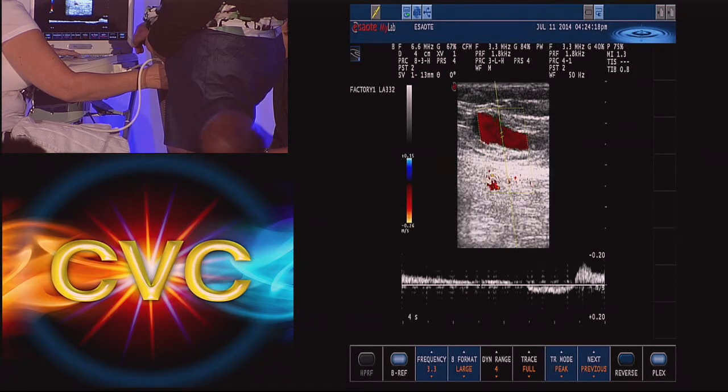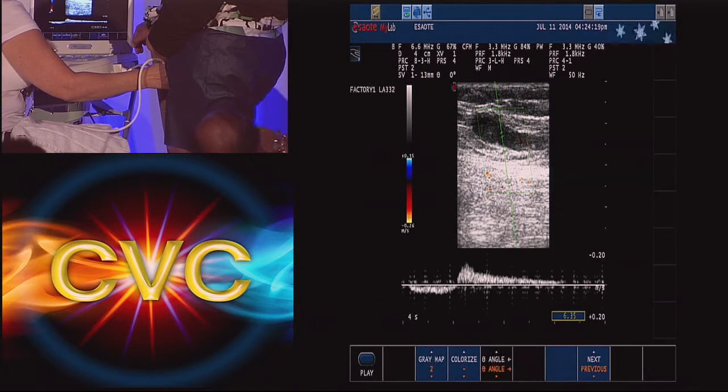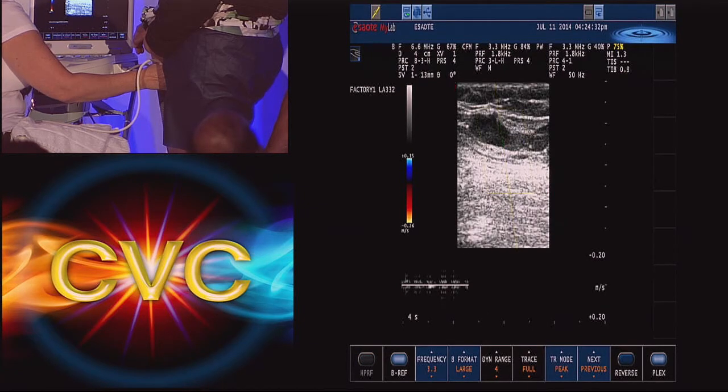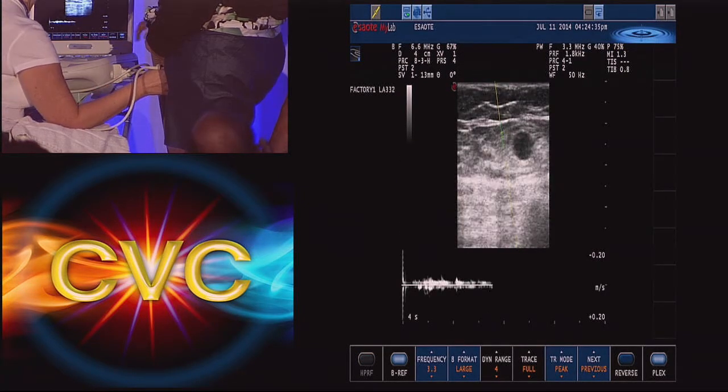She augmented, you saw that? And then this went from here where the flow reversed. It should have stopped right here, roughly right here, but in fact, it just keeps going back. That means the valve's incompetent. You need these pictures if you get audited, for somebody to say, yes, there actually was something.